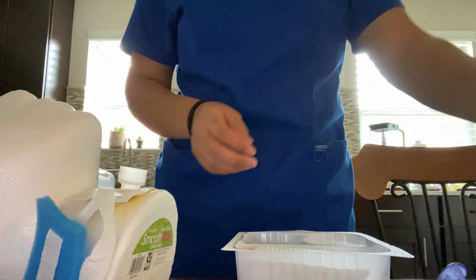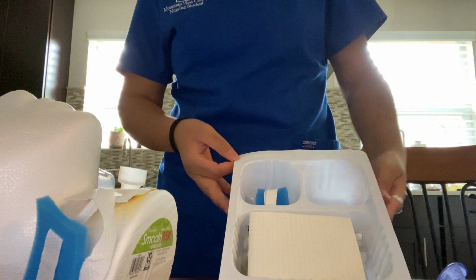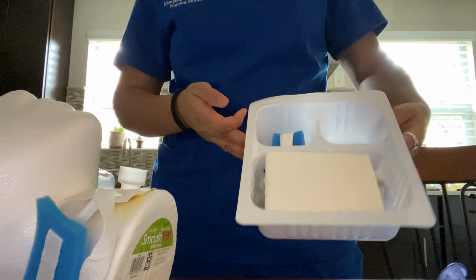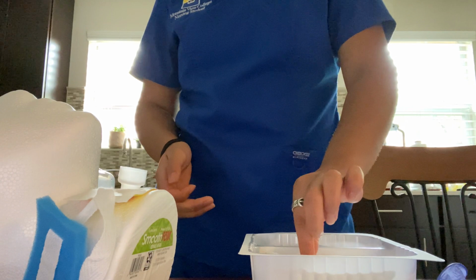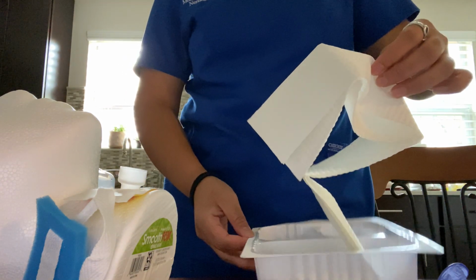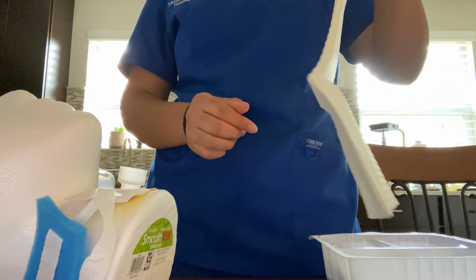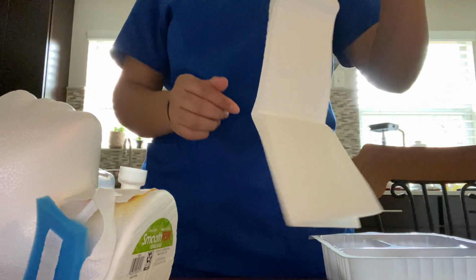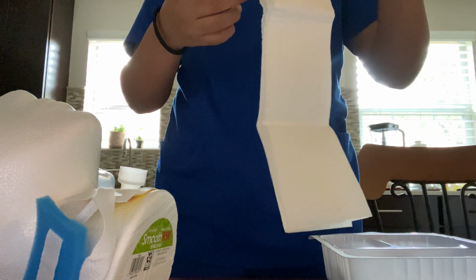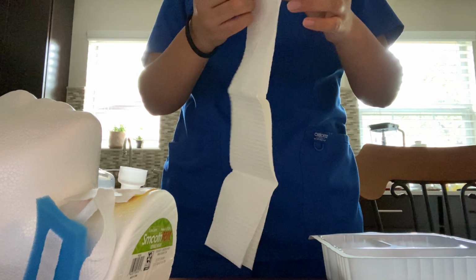All right. So here's a view of it. Then I'm just going to grab the tip of the drape, and we're going to make sure we put the shiny side down.